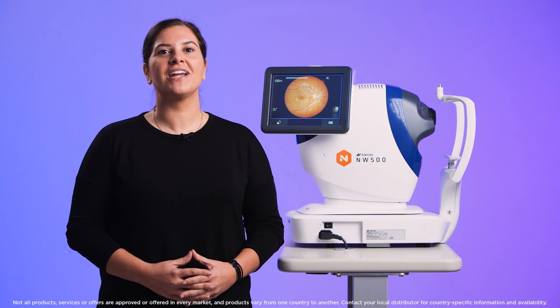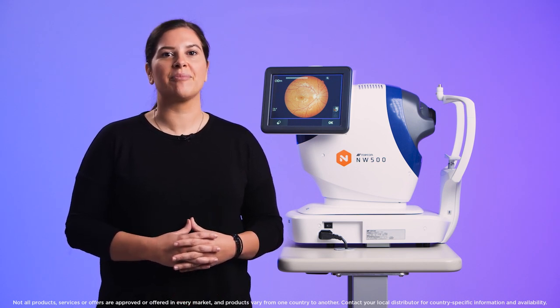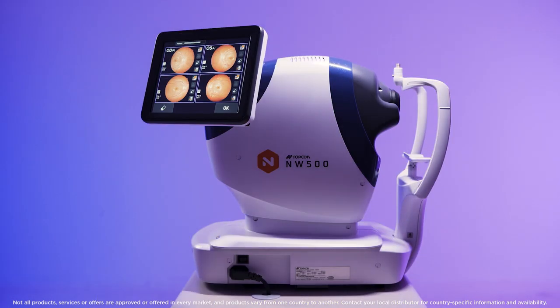Hi, I'm Mary from Topcon Healthcare University and I'm going to show you how easy it is to capture a photo of the anterior segment using manual mode on the NW500.